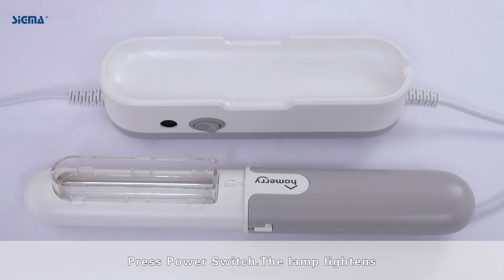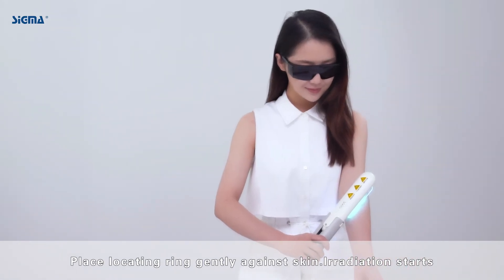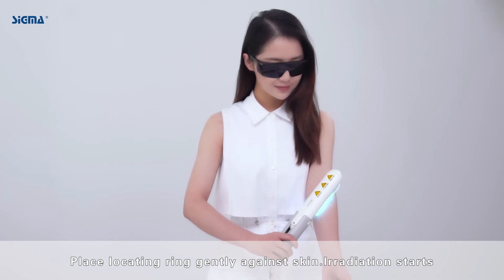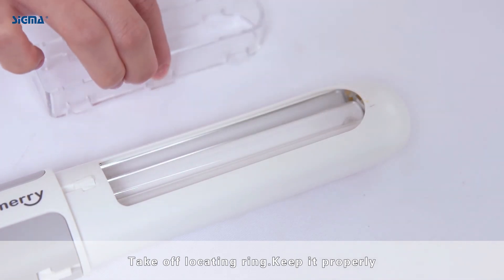Press the power switch. The lamp lightens. Place the locating ring gently against the skin. Irradiation starts. When time is over, press the power switch to end irradiation. Take off the locating ring and keep it properly.